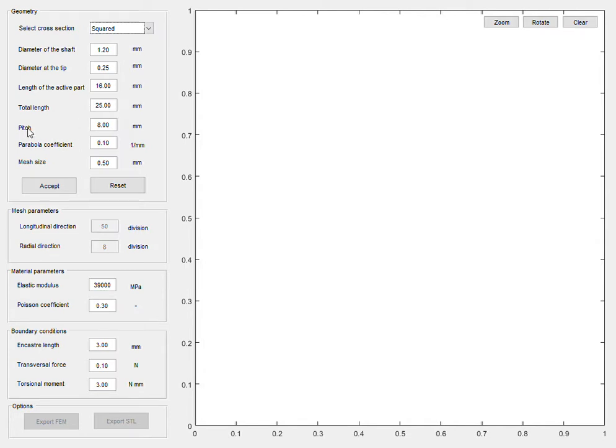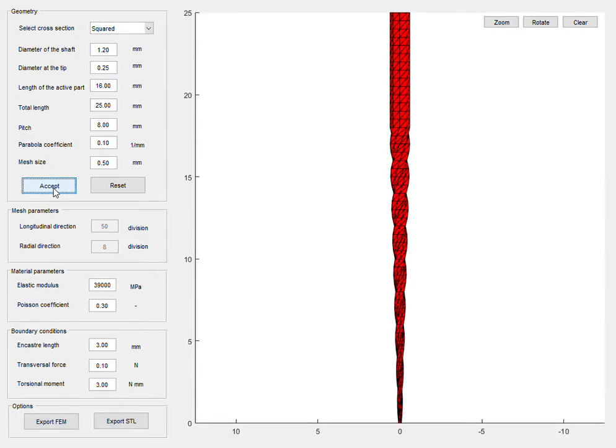We also can define a pitch and the parabola coefficient, that is a coefficient that allows us to provide a smooth transition from the active part to the shaft. And finally, here we have the size of the mesh that will be generated for the geometry. If we accept these parameters as they are, we can see here that the geometry has been generated.